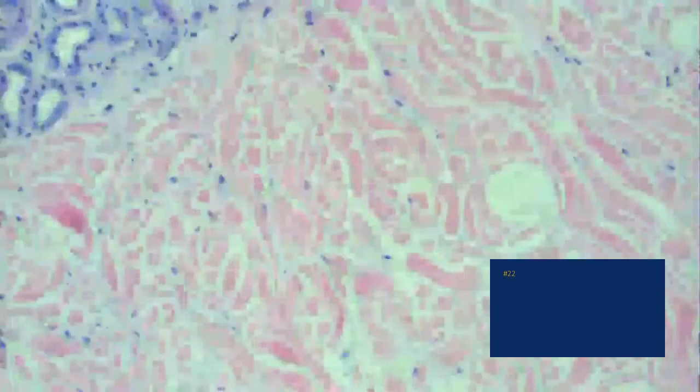Yeah, good. And it's probably on the scalp. So it's probably discoid lupus with alopecia. And so it's a nice example at low power of one of the lymphocytic infiltrates. So obviously there are a bunch of those, right? And what else is present here that helps you in distinguishing this, say, from polymorphous light eruption?